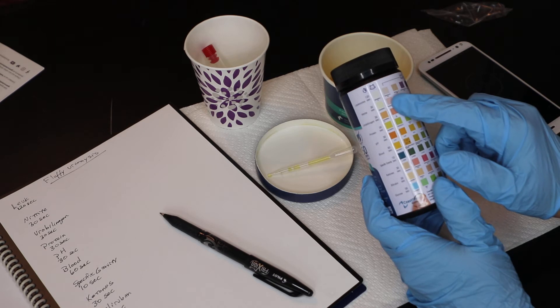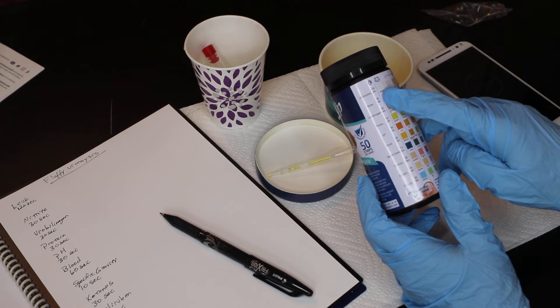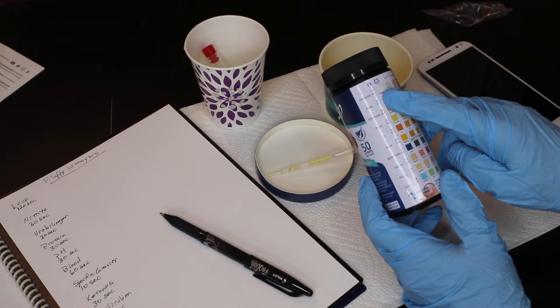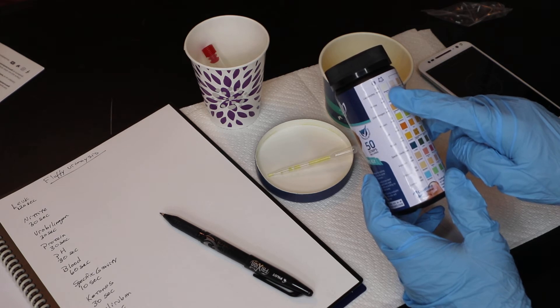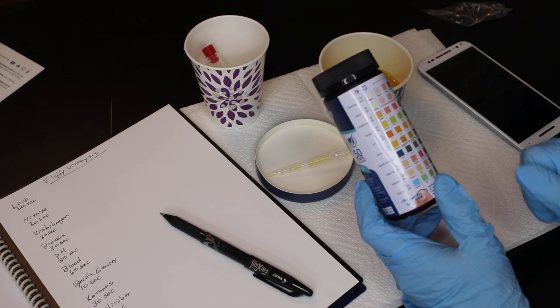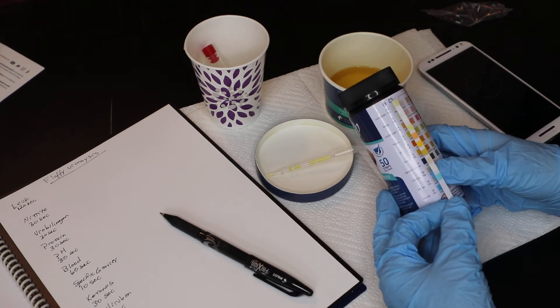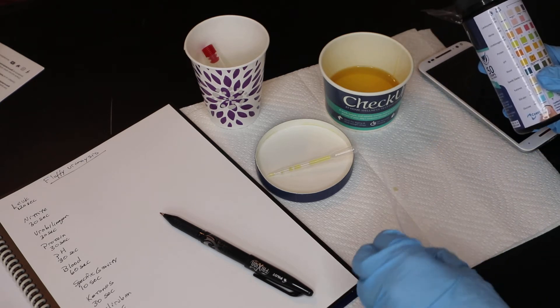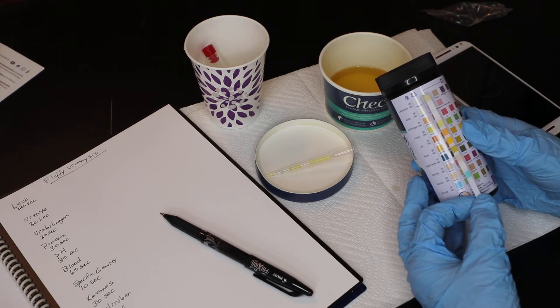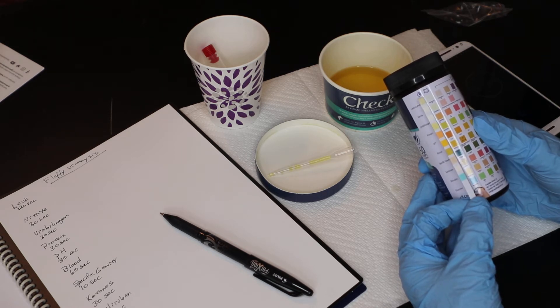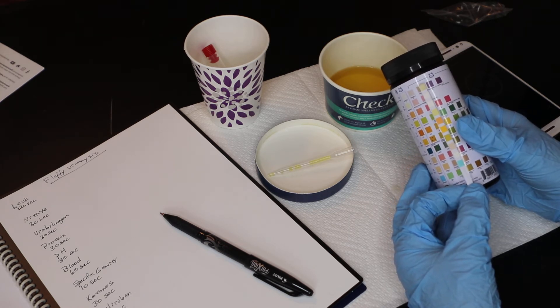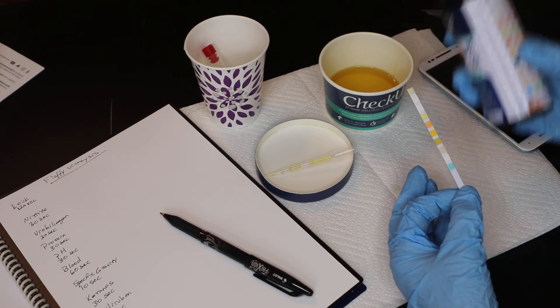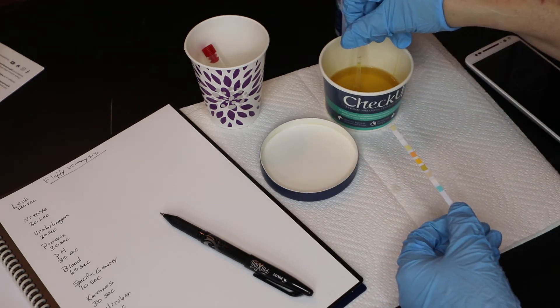You can see here that it goes from trace all the way up to a large amount of leukocytes. Leukocytes are important because what that is looking at is the white cells in the urine. And if there's white cells in the urine, a lot of times that can mean that there's inflammation or that there are other things going on like an infection in the bladder. So we've run our 120 seconds and we're going to compare that. You might have to dab off a little bit of urine if it's a float up or a bubble on the pad.